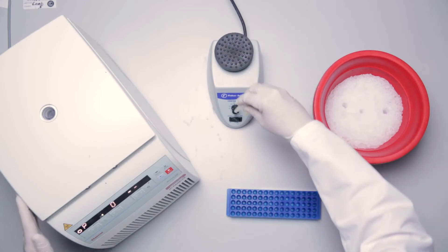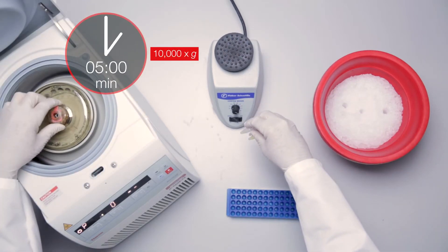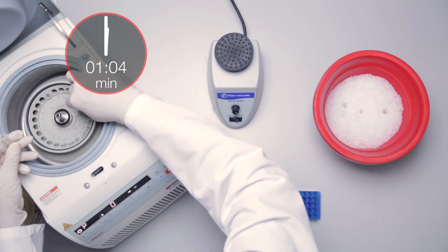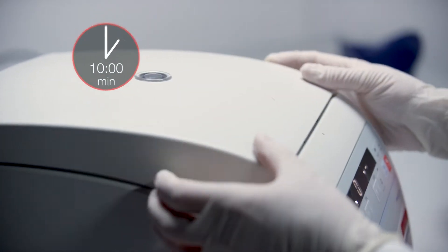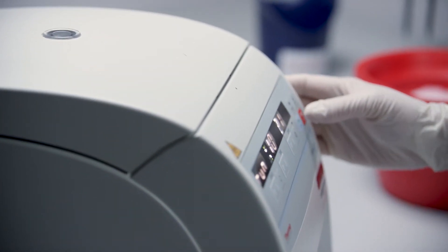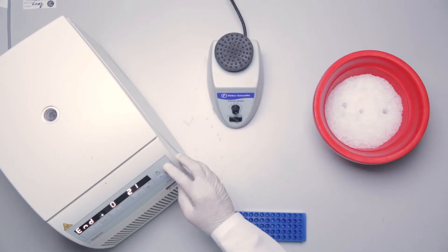Centrifuge at 10,000 g for 5 minutes to remove particulates, or for 10 minutes if samples are high in lipid content. Transfer the contents to a new tube. Avoid multiple freeze-thaw cycles.